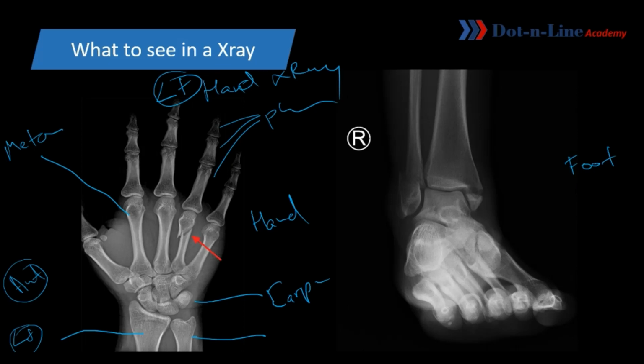Okay, so these are the methods. You will find your own methods to do all these things, but repeatedly learning and reading the X-ray will improve you in it. This is gray flesh. Okay, this is the defect in this X-ray. Metacarpal is fractured at the level of shaft. These are the carpals you see.